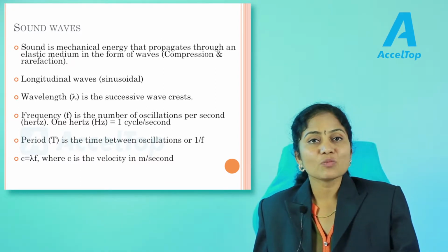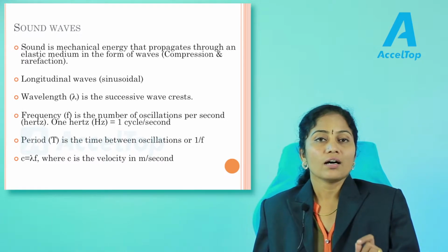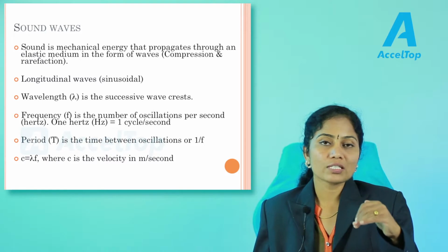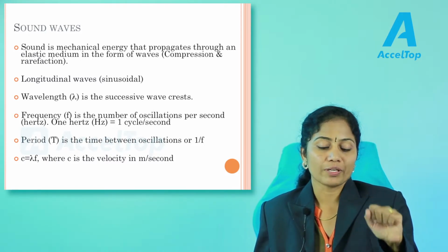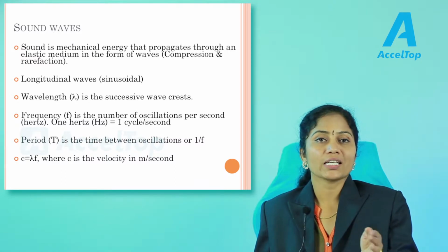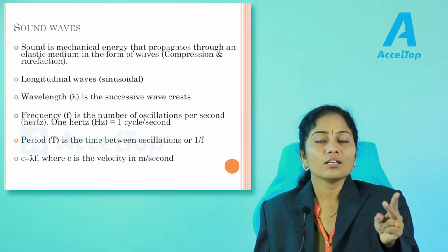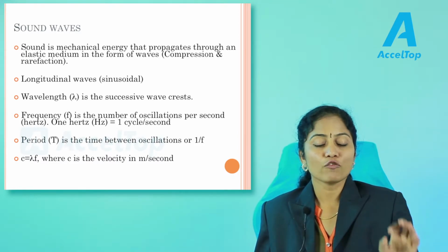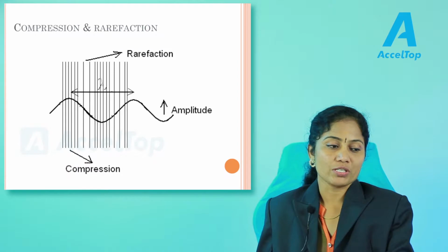And also it is the modality of choice for gallbladder related diseases. So I would like to first tell the basics of ultrasonography. We know ultrasound is a form of mechanical energy. It has a dual propagation method. One is in the form of waves and the other is in the form of rarefaction and compressions.